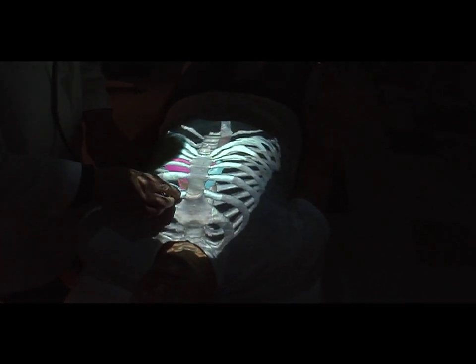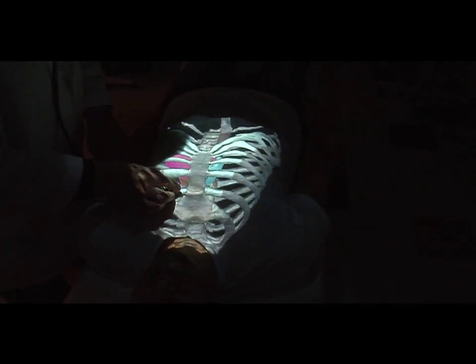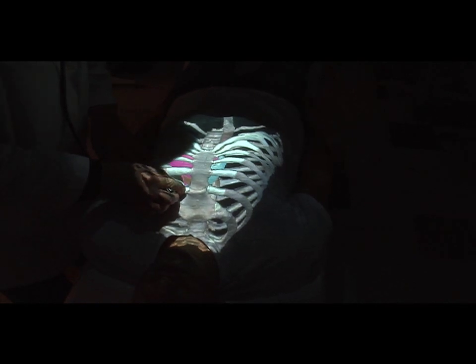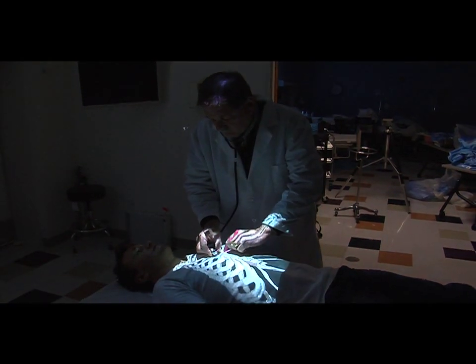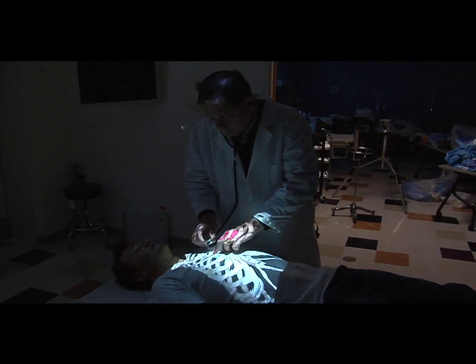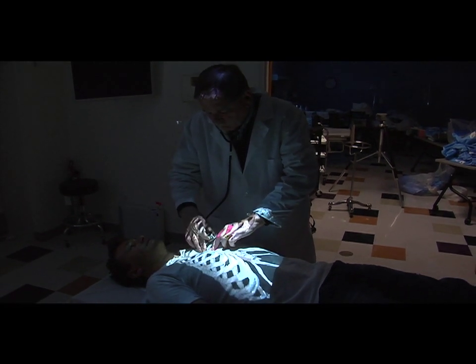For example, in a lesson on heart sounds, a student attempts to locate the pulmonary valve with a stethoscope, without success. The projection of visible human anatomy onto the patient gives the student a new way to see the location and its significance.